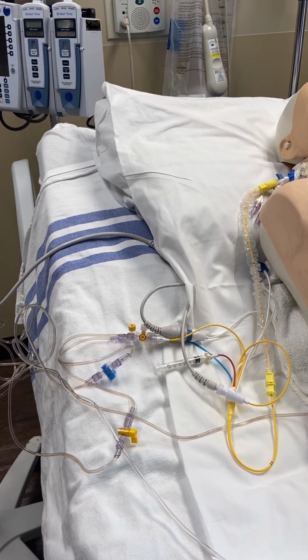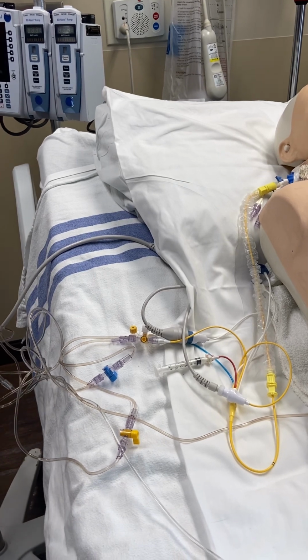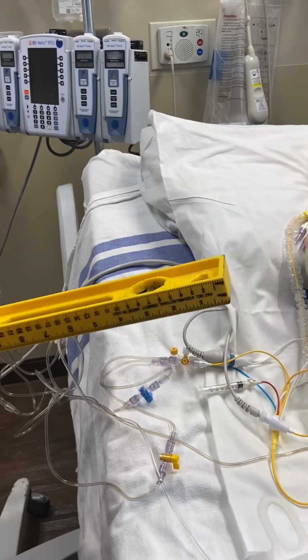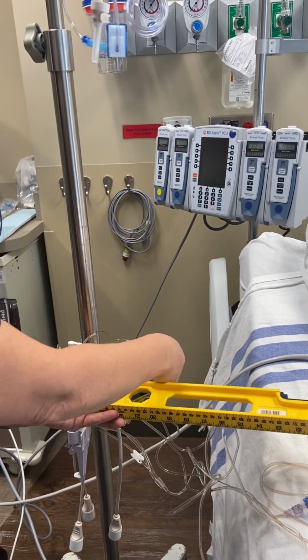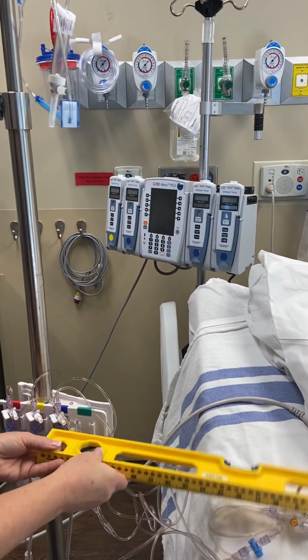The biggest thing that we want to make sure you guys are doing is making sure that you're leveling and zeroing your patient appropriately. You should be using the leveler to level with the mid-axillary line with your transducer, okay?